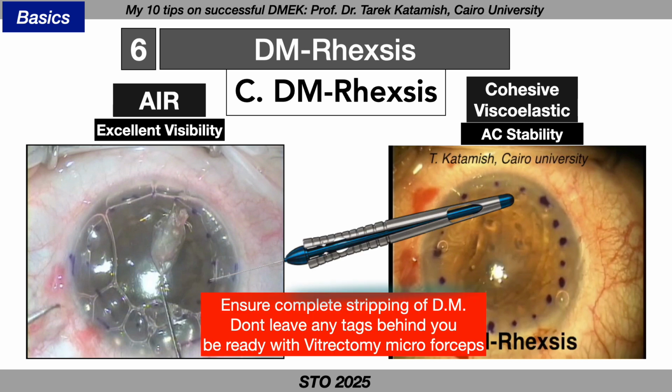As I have mentioned, ensure complete stripping of Descemet membrane. Don't leave any tags behind you. Be ready with microforceps to catch and remove any tags away from the wound.